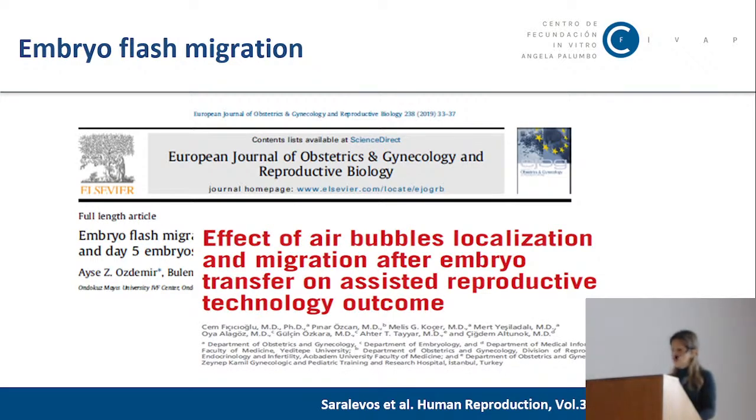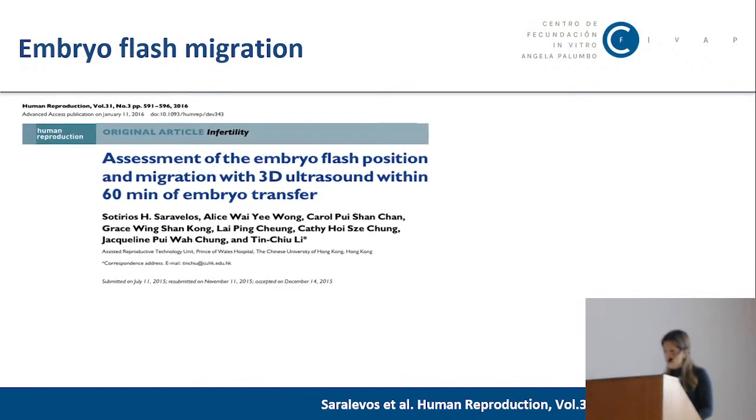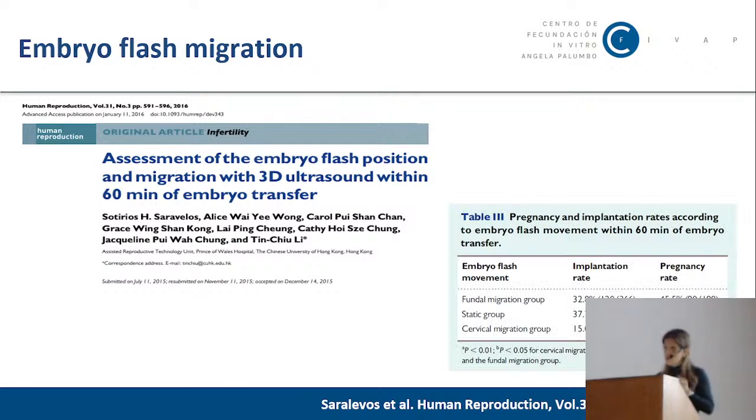Saravelos in 2016 showed that embryos can move following the transfer, and that those moving towards the fundus had higher pregnancy rates compared with those moving to the cervix.